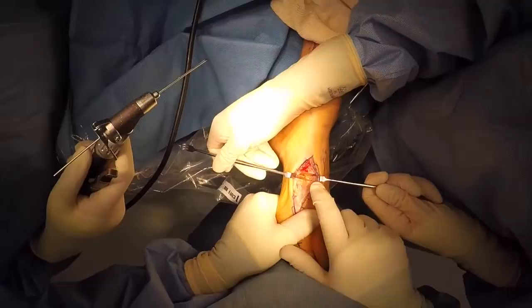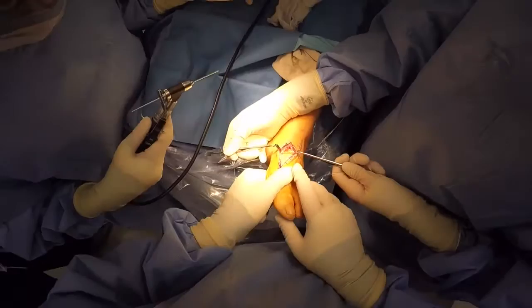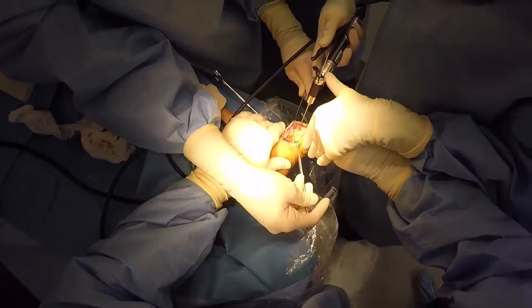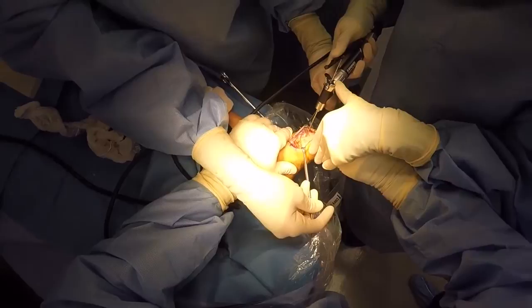In many cases, a retractor placed against the bone surfaces may be necessary to retract the bone for fenestration and preparation of the joint surfaces. However, in this case, our cuts were sufficient and we were able to utilize a trocar tipped wire in this case to fenestrate the bone in preparation for fusion.